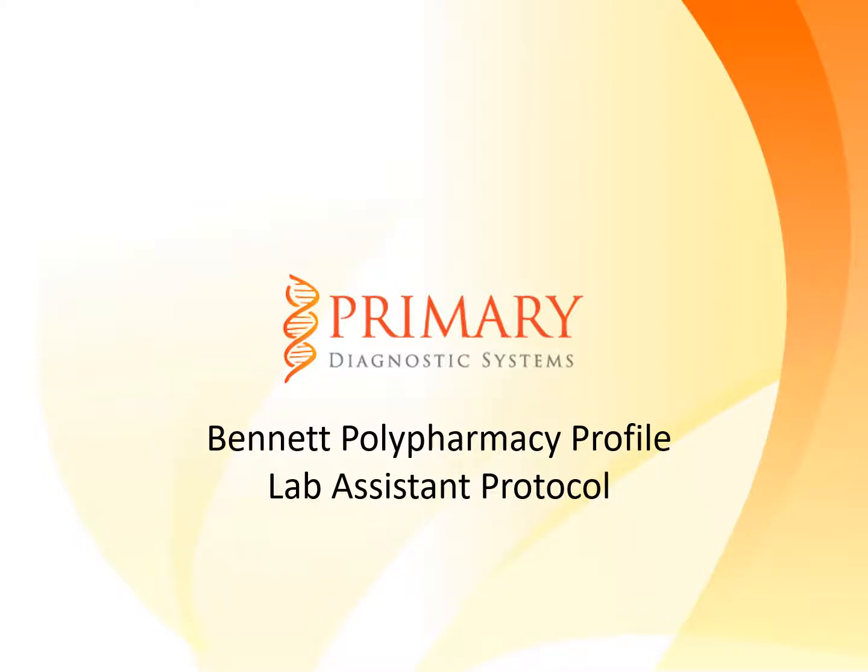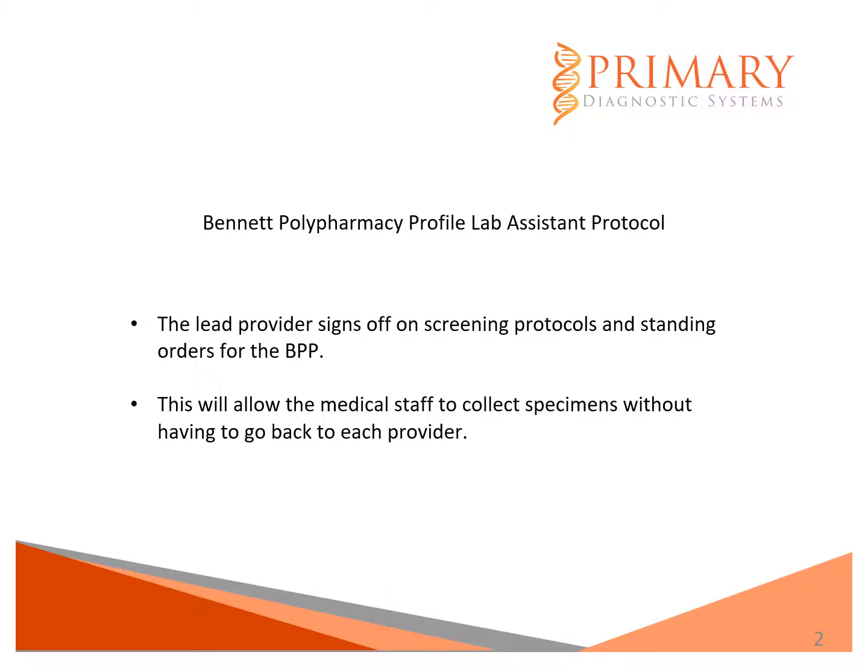The following presentation outlines the steps required for correctly processing patient specimens for the Bennett polypharmacy profile. The very first step in the process is to have the lead provider sign off on screening protocols and standing orders for the BPP. This will allow the medical staff to collect specimens without having to go back to each provider.